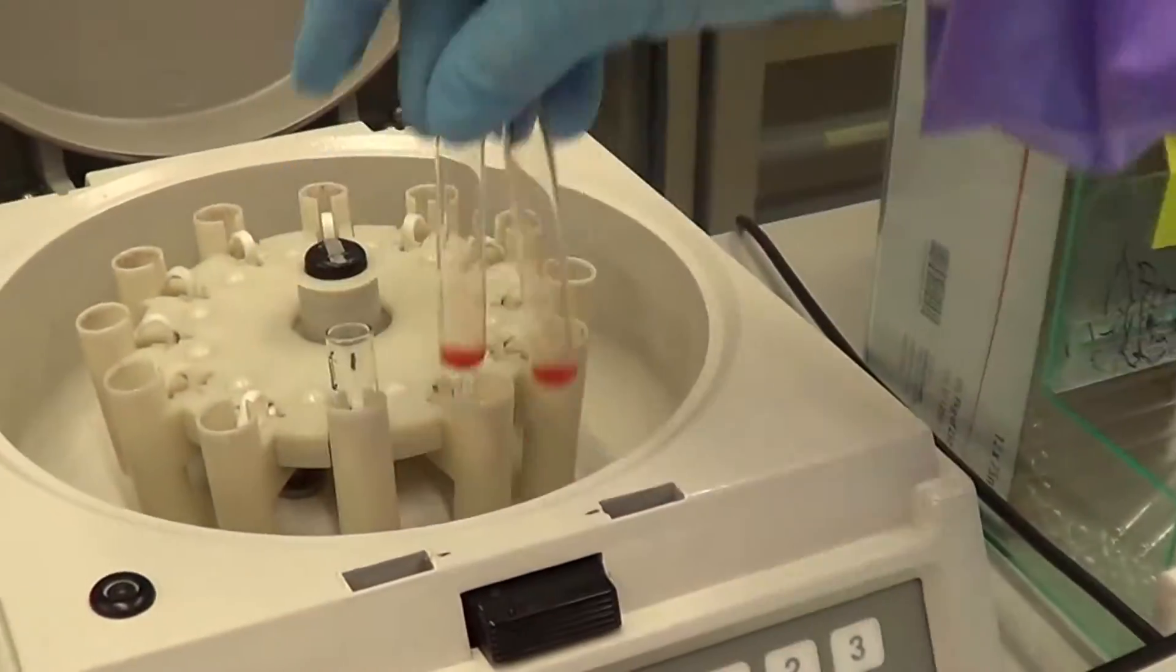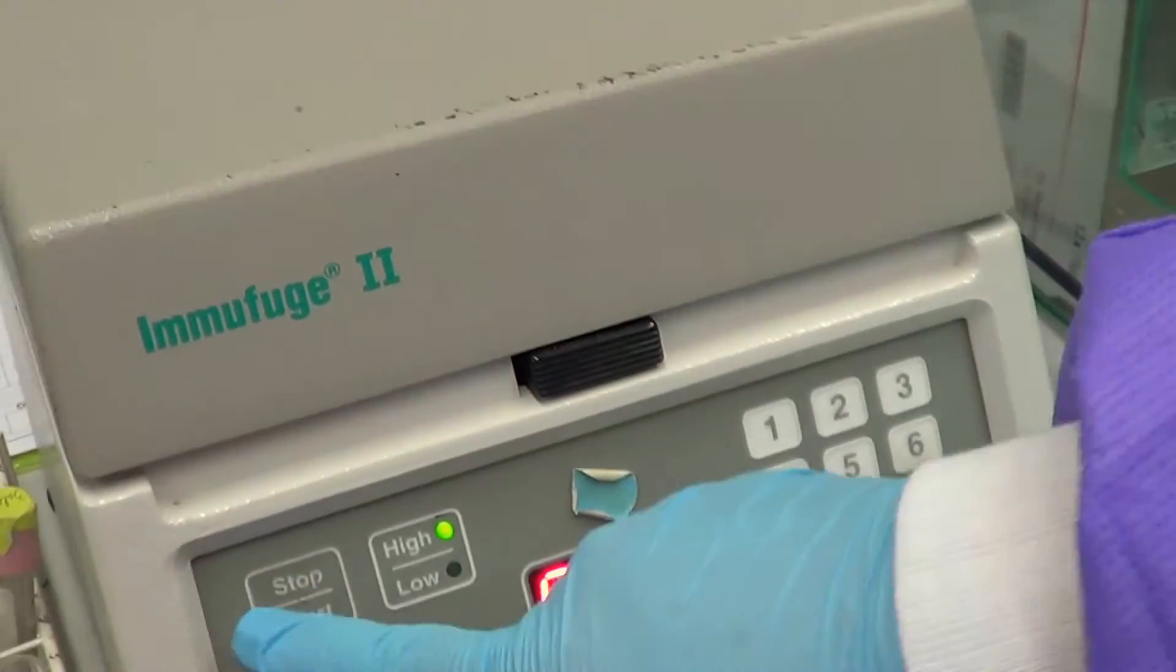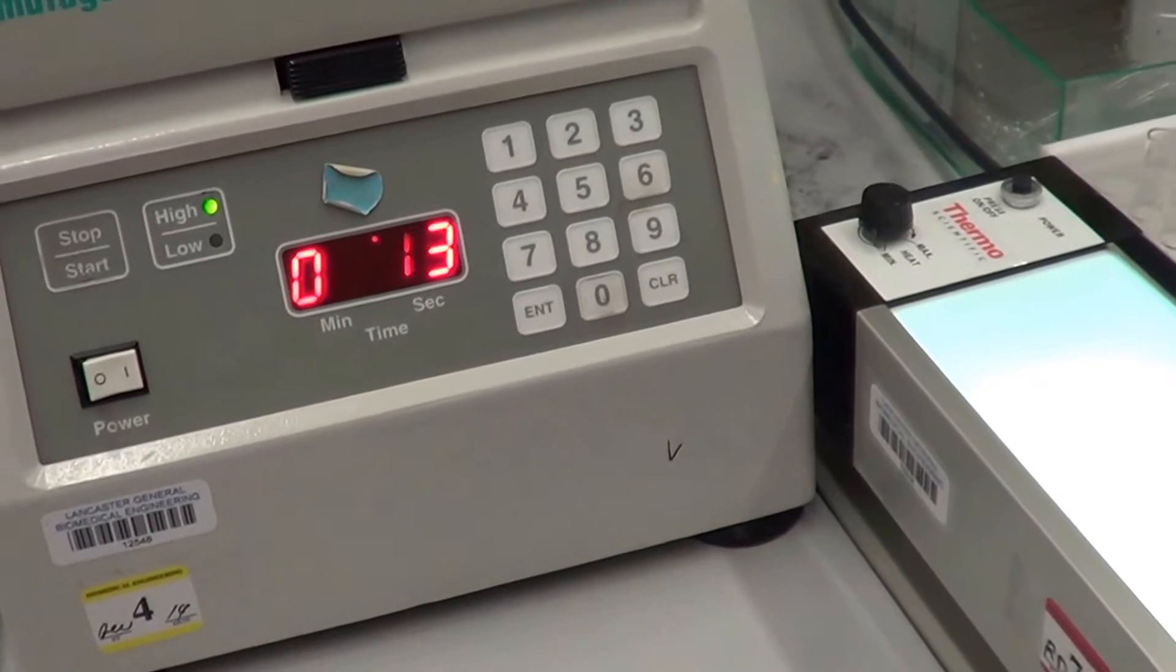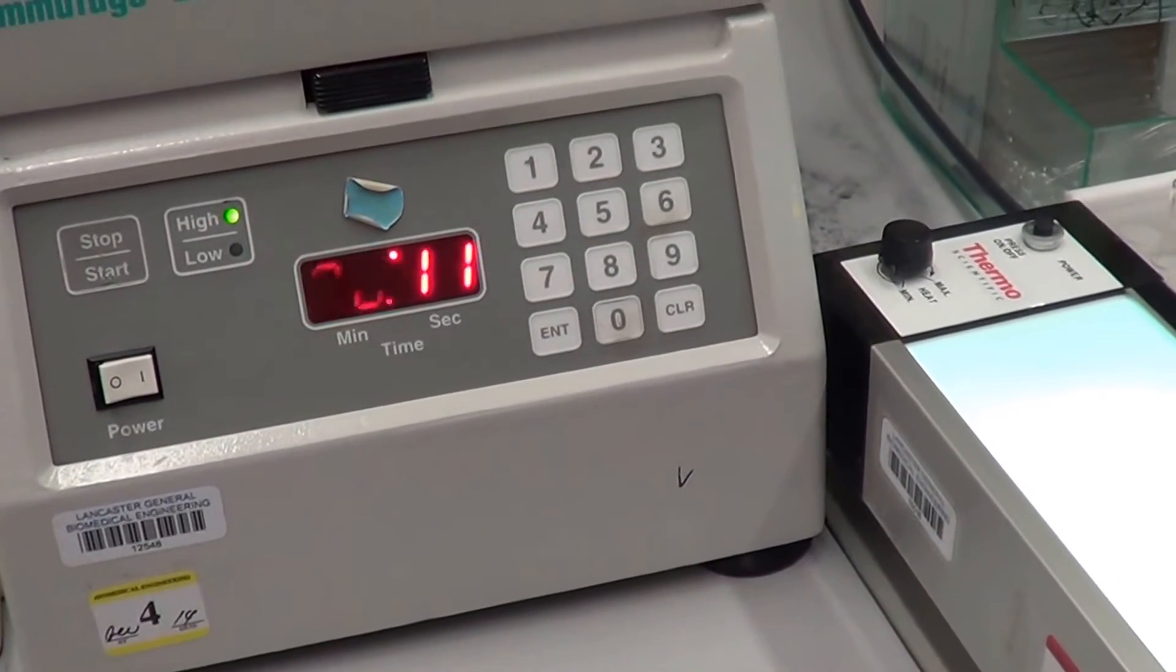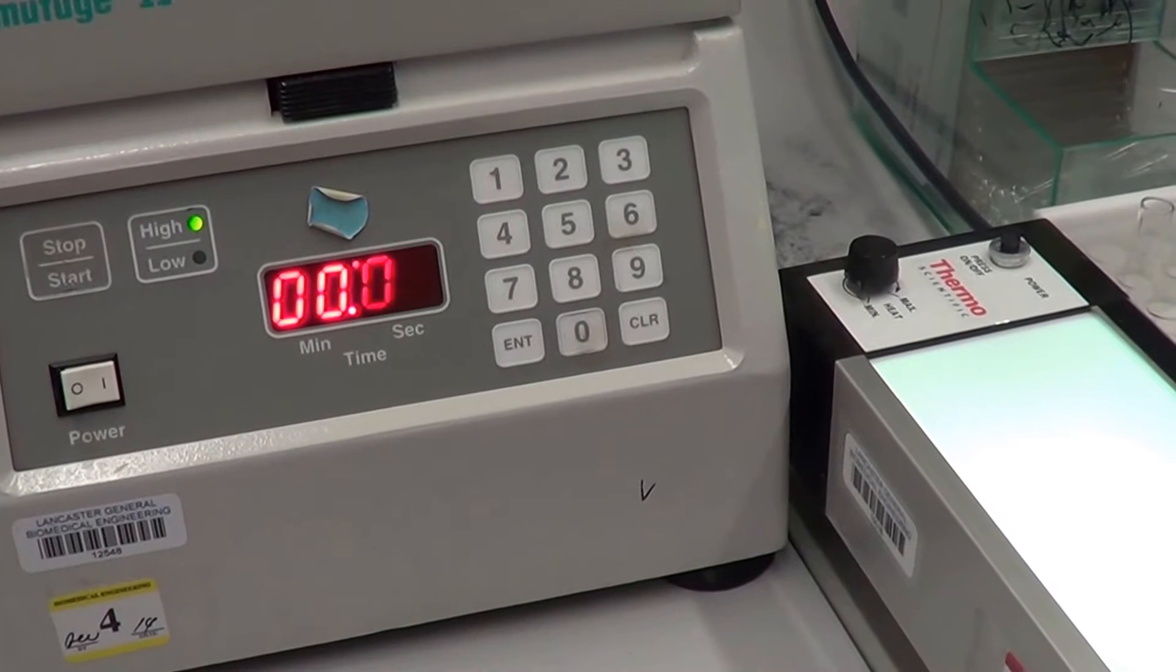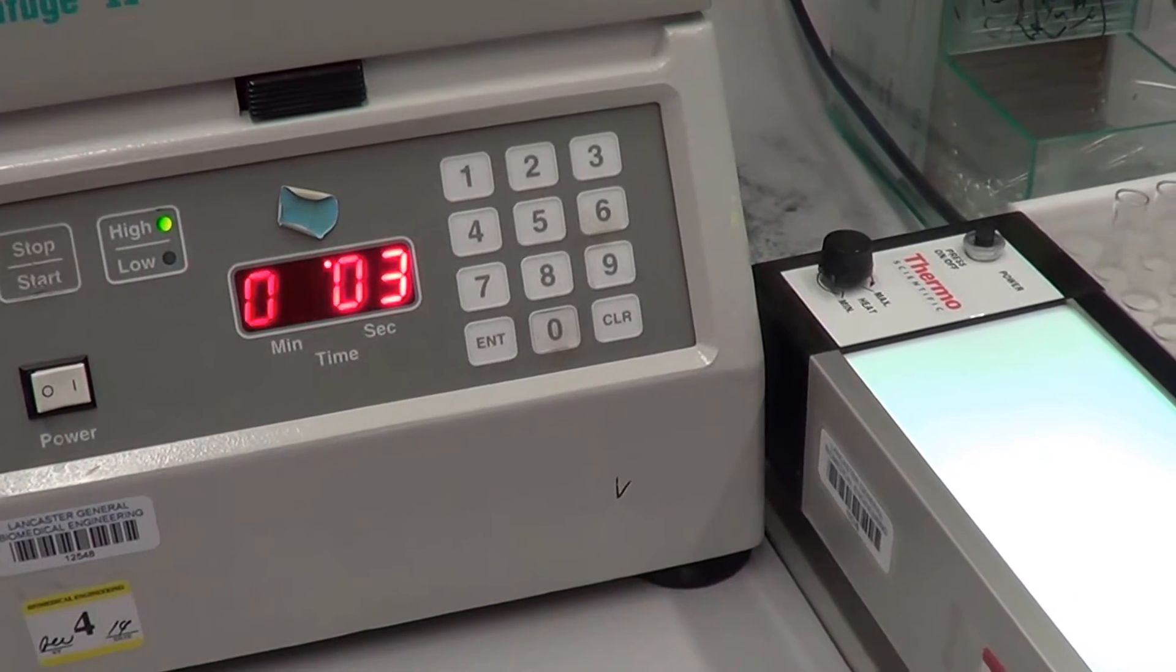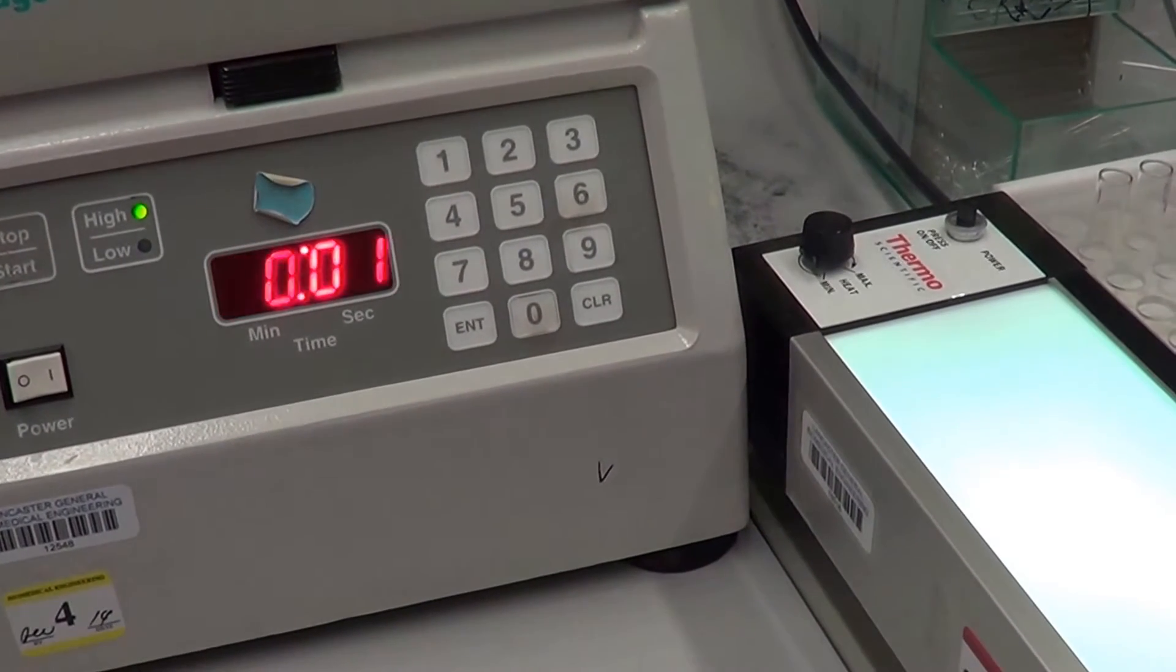You spin them. This is a quality control test. The anti-IgG that was added should be free to bind onto the check cells that are coated with IgG.